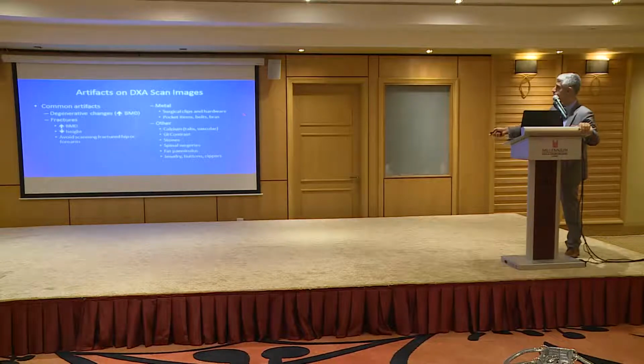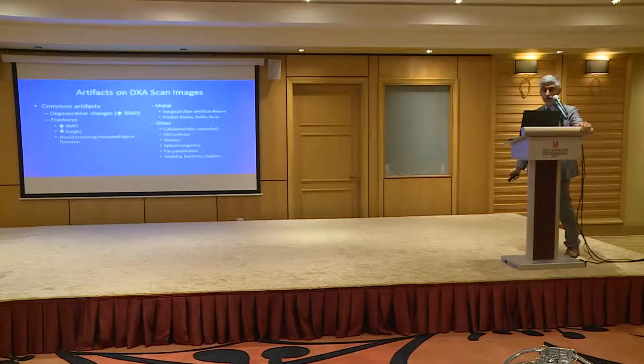And in terms of metals, you can have some metals there. We already mentioned them, and some of the other ones, we already showed pictures of these artifacts.